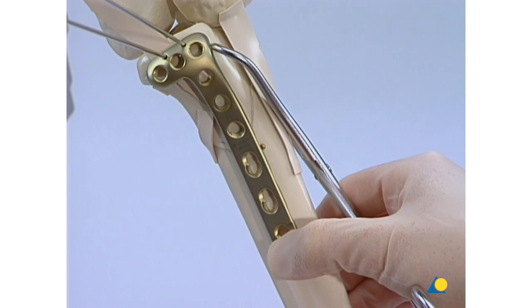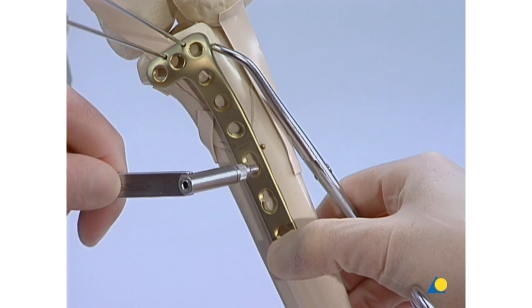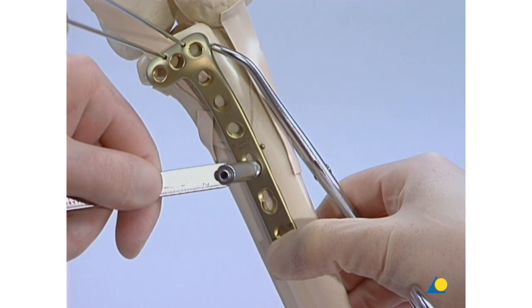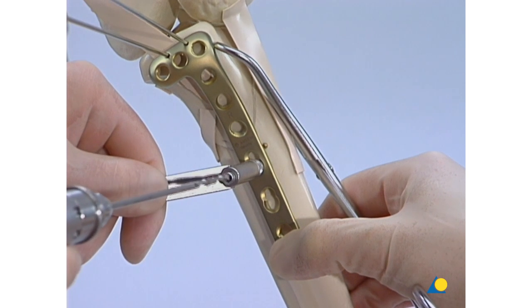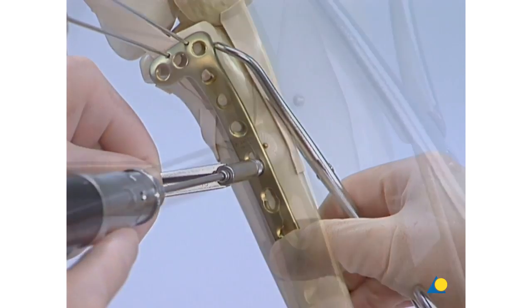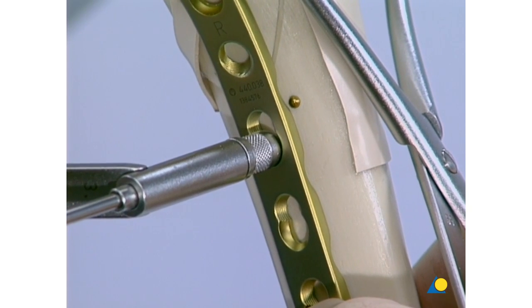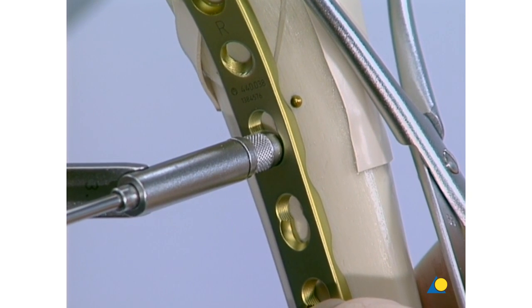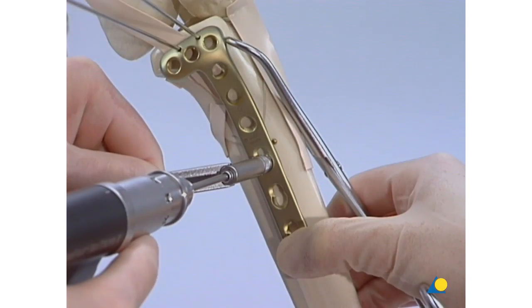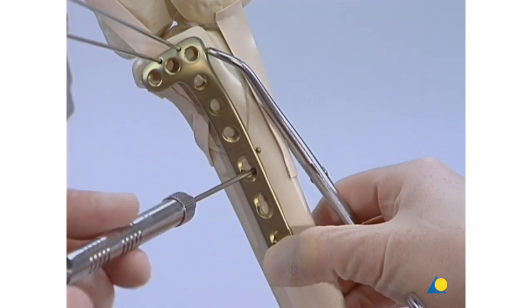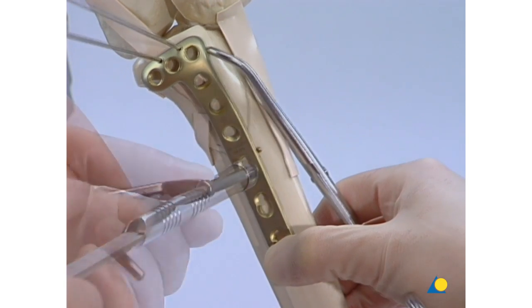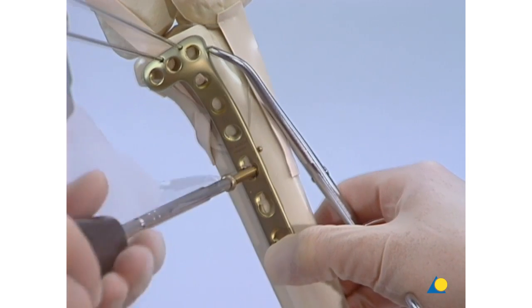The first screw is inserted through the plate hole, just distal to the apex of the fracture. The 4.5-3.2 universal drill guide is used in the neutral position. Both cortices are drilled through using the 3.2 millimeter drill. After measuring and tapping, the 4.5 millimeter cortex screw is inserted.